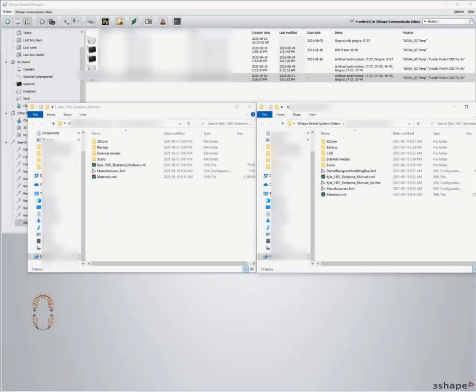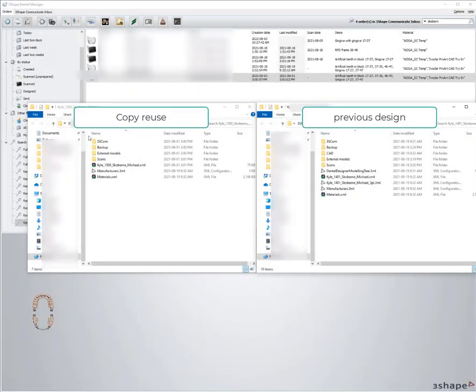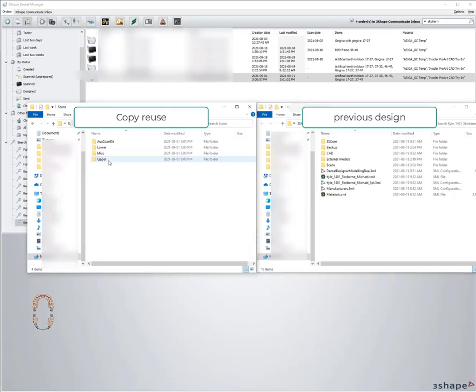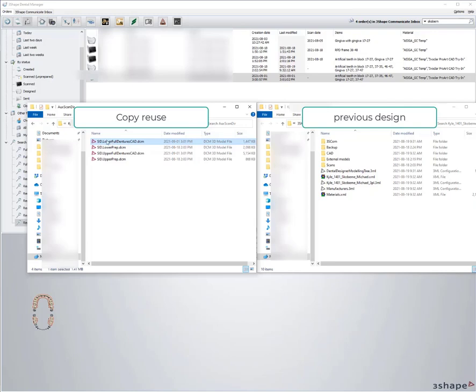I'm going to go into the copy and reuse CAD one and I'm going to go into the scans. I'm going to go to auxiliary and I'm going to find the one for the lower full denture.